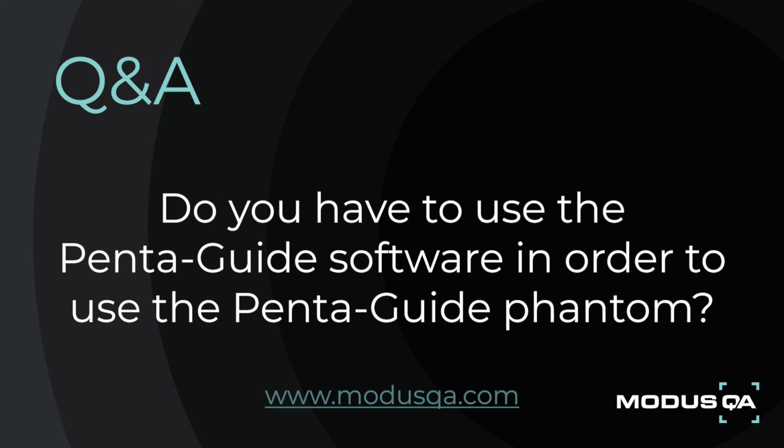Okay, do you have to use the software in order to use the Phantom? No, you don't have to use the software with the Phantom. We highly recommend it based on the valuable information it provides. However, there are many departments that use the Phantom with their linac console tools, and then they keep track of their daily shifts using a spreadsheet.